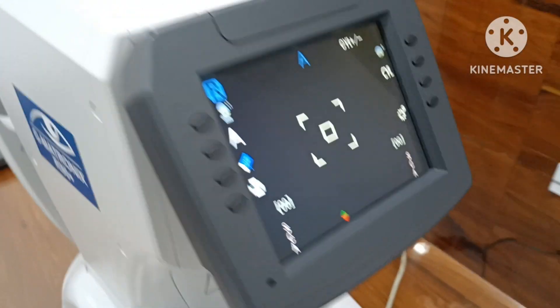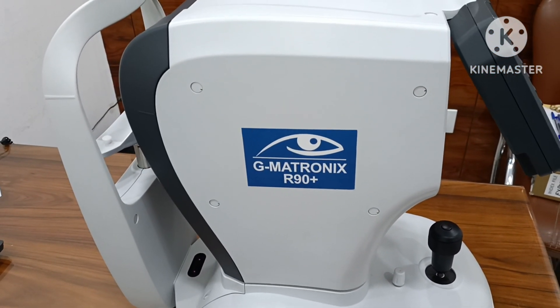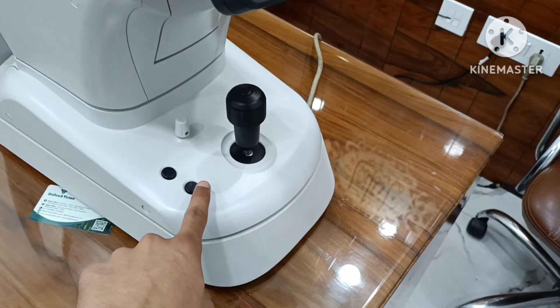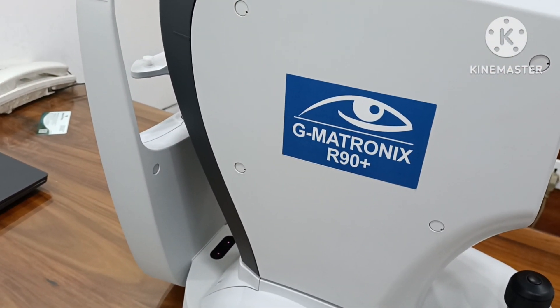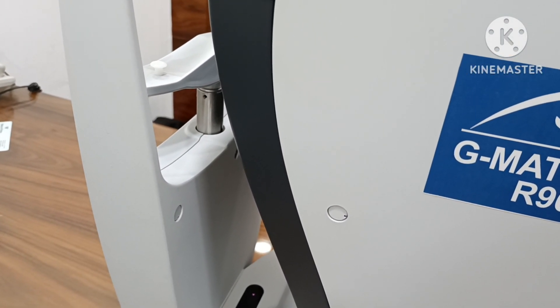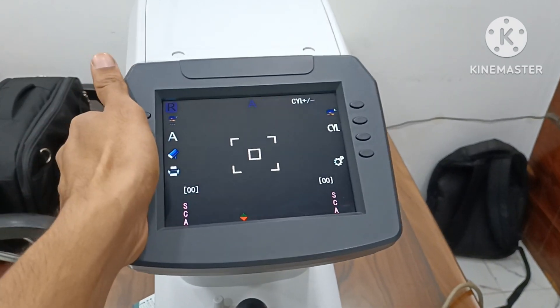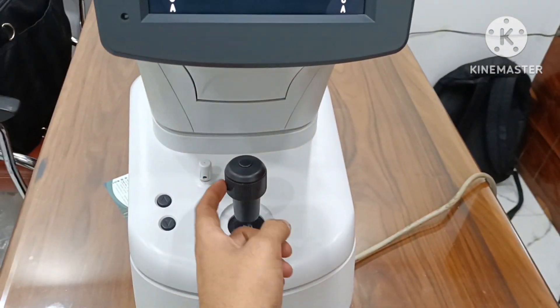Motorized chinrest available — you can move it up and down by switches. Tiltable head up and down by joystick very easily.